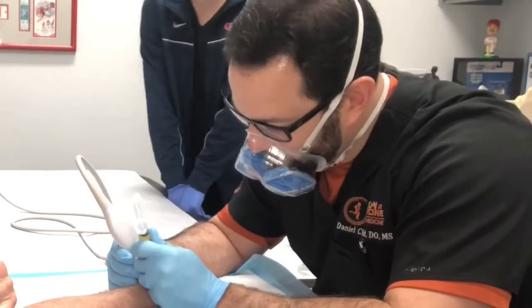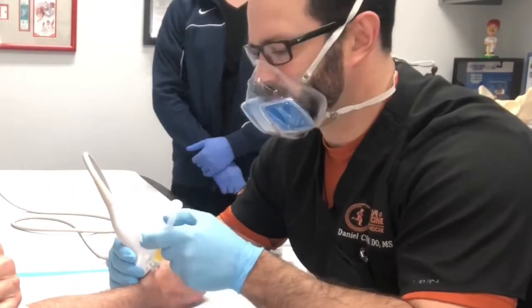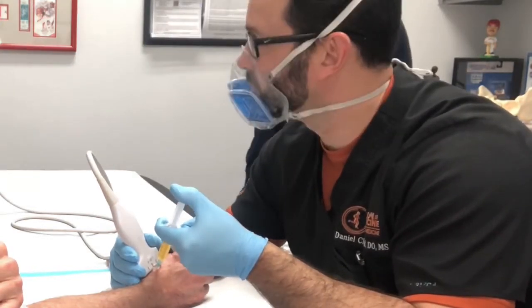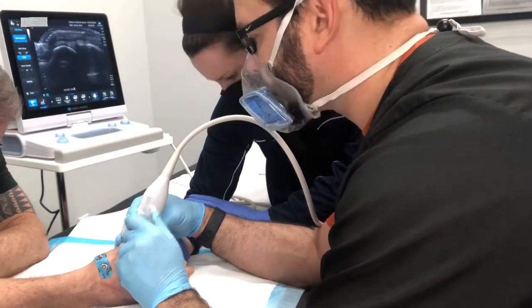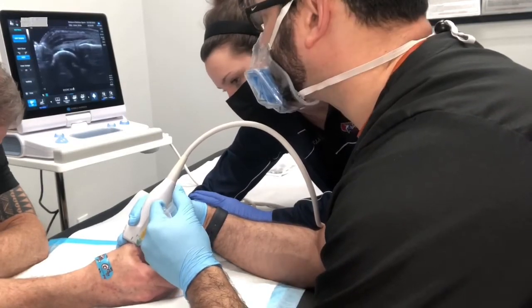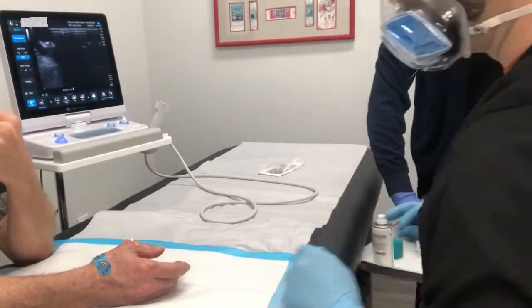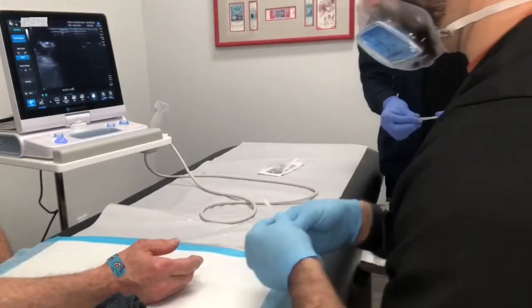As you can see here, we're going to be treating a hand, a thumb. I'm locating it on the ultrasound before I perform the injection, and then I'm going to inject the PRP into the respective area. Since it's numb, the patient can feel a little bit of pressure but they shouldn't be feeling any pain. We can make sure that we have it exactly where we want to, to make sure that it's going to work best. And we're done with the procedure. Afterwards we're going to get the area all cleaned up and get you on your way to recovery.